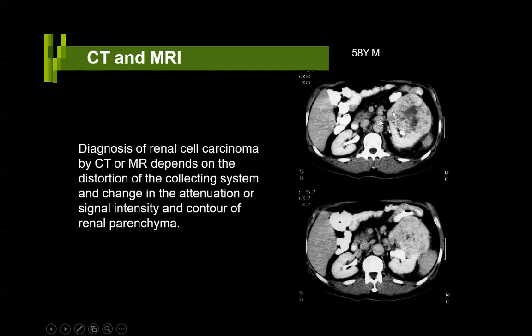If you look carefully, you can also see a few lymph nodes in the para-aortic region. So obviously, for staging of the tumor, you need to know exactly where the tumor is, because the surgeon wants to know whether this is resectable or not. We'll talk of this later, where we will tell you which tumors can be resected. The same information you can also get on MR. Okay.